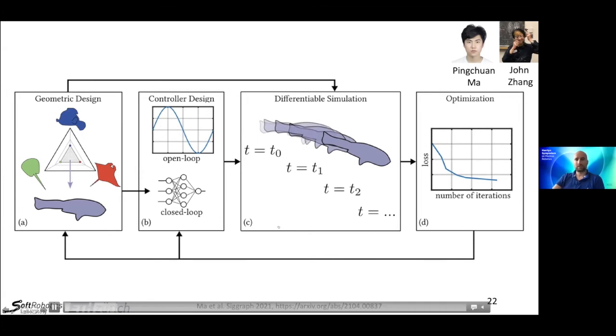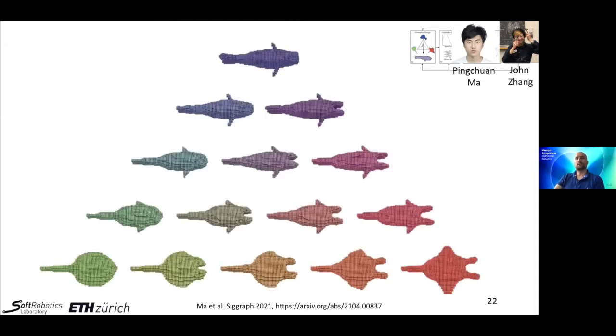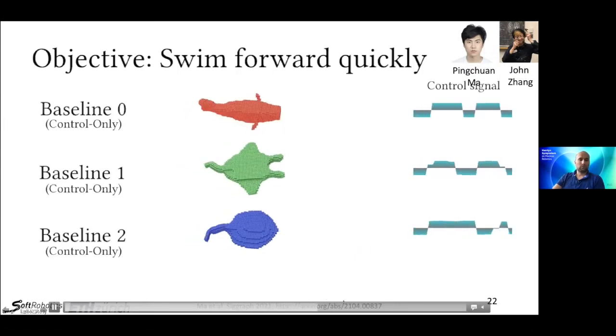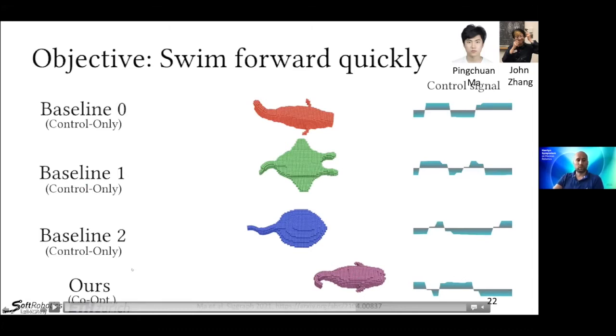So what we did here essentially was to say, we take, for example, these 3 different swimmer designs, and we are then able to take them and interpolate between them, having all these muscles built into the structures, with continuous variation points between those designs. And then we are able to say, let's take this and optimize it for a control policy and a design at the same time. And to show, when you start off with just the 3 initial designs, you can optimize for the control only, or you can optimize both for the design and control. So we came up, for example, with this hybrid sim you see here at the bottom, that is faster. It has its own optimized controller compared to all of the initial designs. So we were not able to come up with this design initially. It came out of this optimization process.